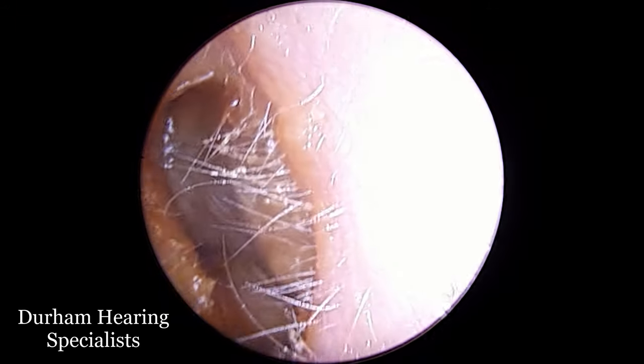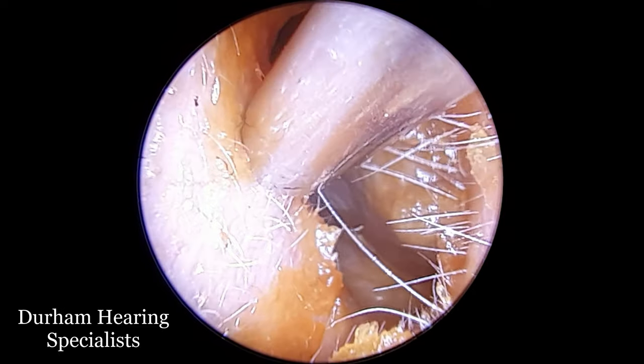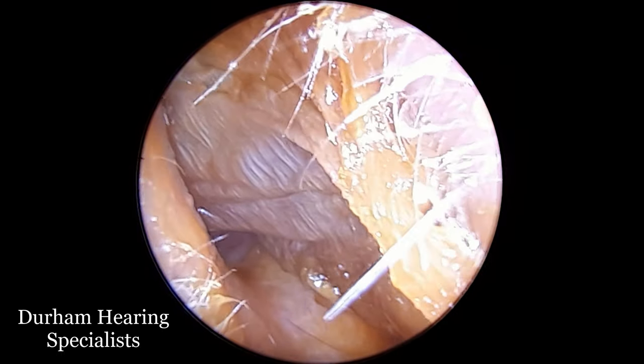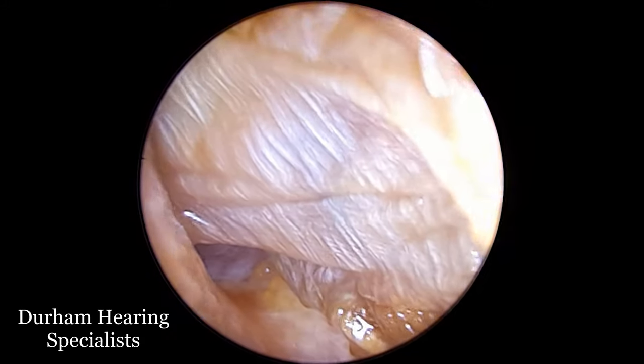Hi everyone, it's Connor here from Durham Hearing Specialists. I hope you're doing well and welcome to another video. We've got quite an interesting case here. What you're going to see in this video is a very well-preserved — well-formed, I should say — mass of dead skin.